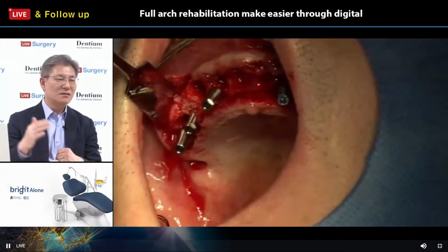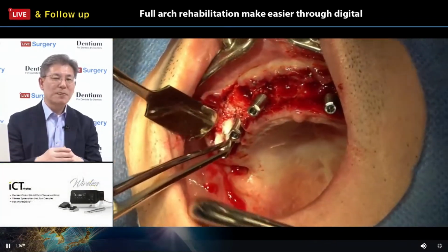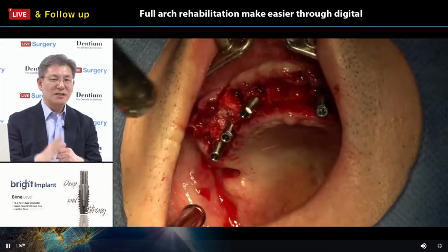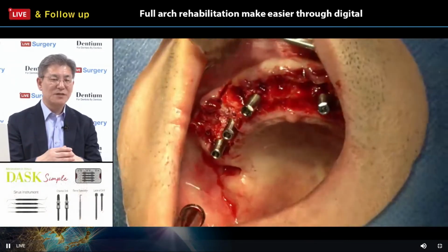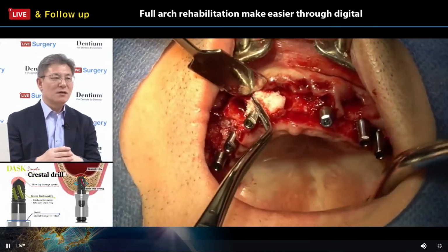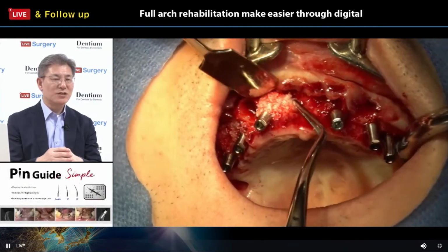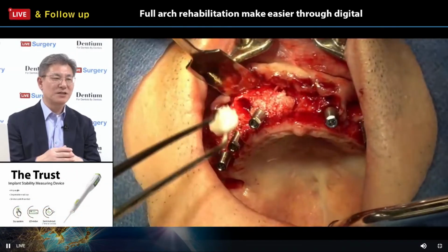The moderate dimension means about 5-6 millimeter of remnant bone. You know the criteria: under 3 millimeter, we need a lateral approach, generally speaking, and from 3 millimeter to 6 millimeter depends on the situation and the surgeon's preference. However, we recommend the crestal approach. At about 6 millimeter, bicortical fixation is a good candidate and good procedure.